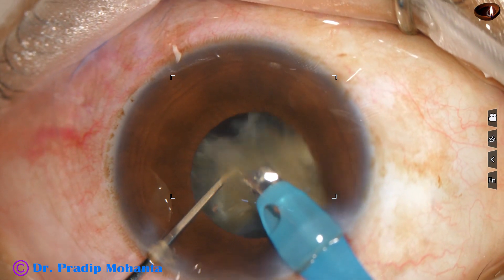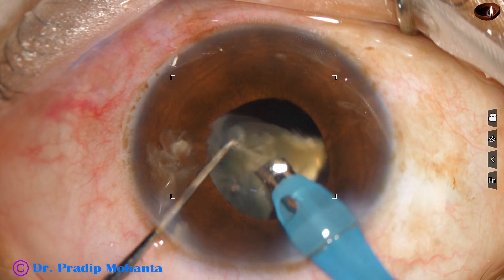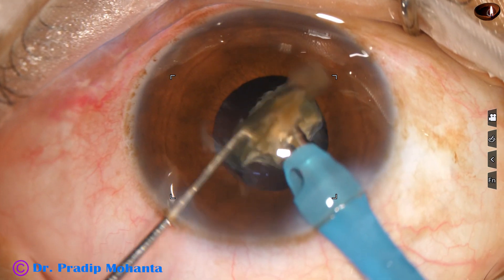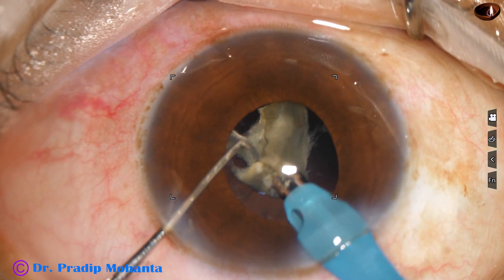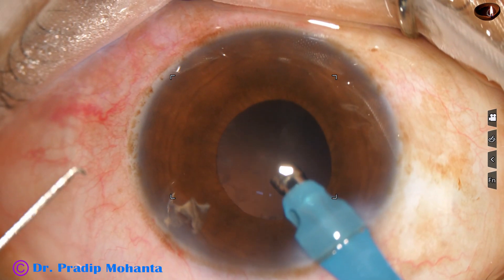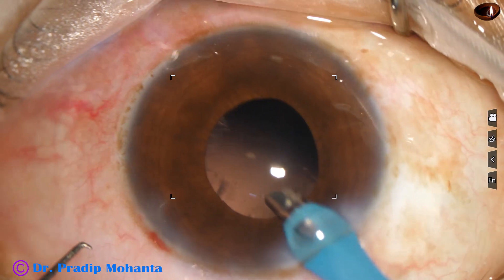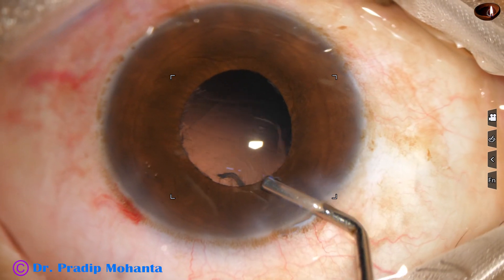Now I divide the semi-nucleus into two parts and each part is emulsified with ultrasonic energy. This is the last nuclear piece. See, there is minimum chatter of the pieces. I use the foot switch in such a way that the pieces do not go here and there. The nucleus is managed nicely, and the smaller nuclear bits are removed through the side port.